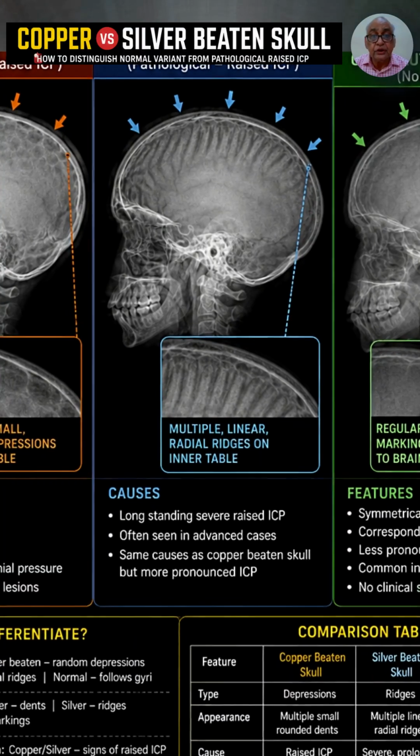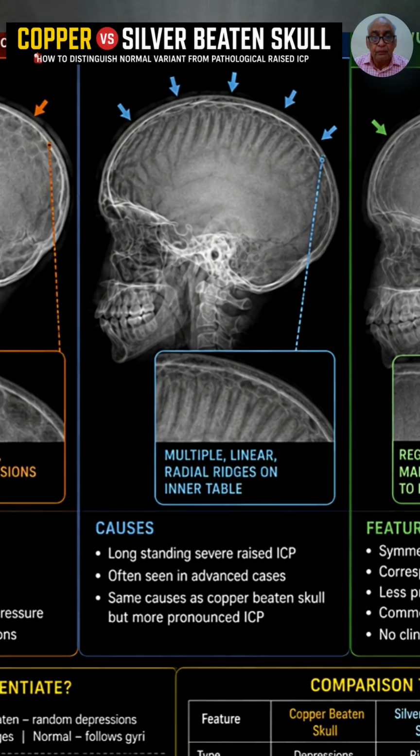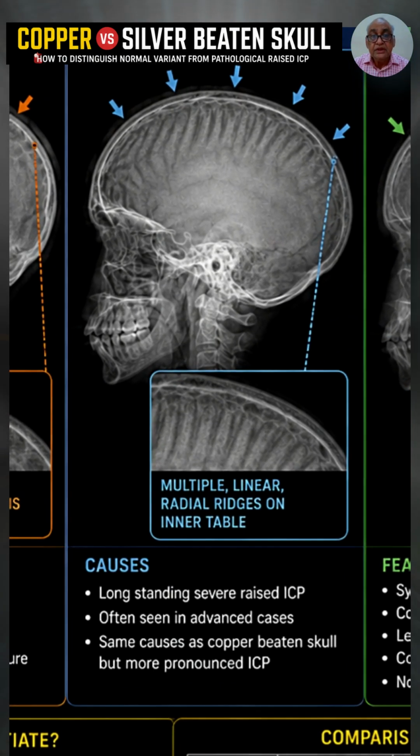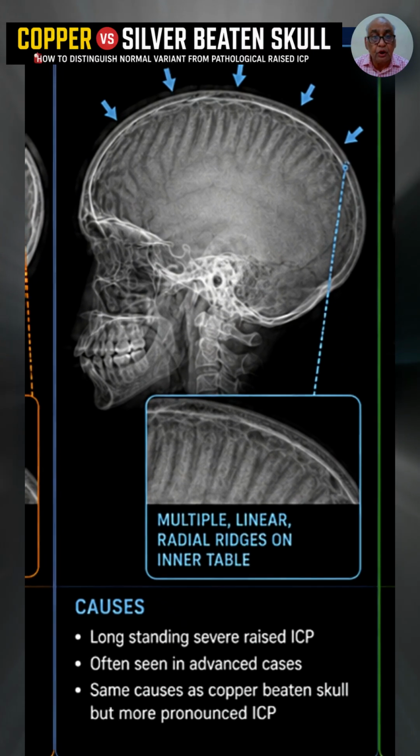In much of the radiology literature, the terms are used interchangeably, while many texts recognize only the copper beaten skull. So always follow the terminology used in your institution or examination system.